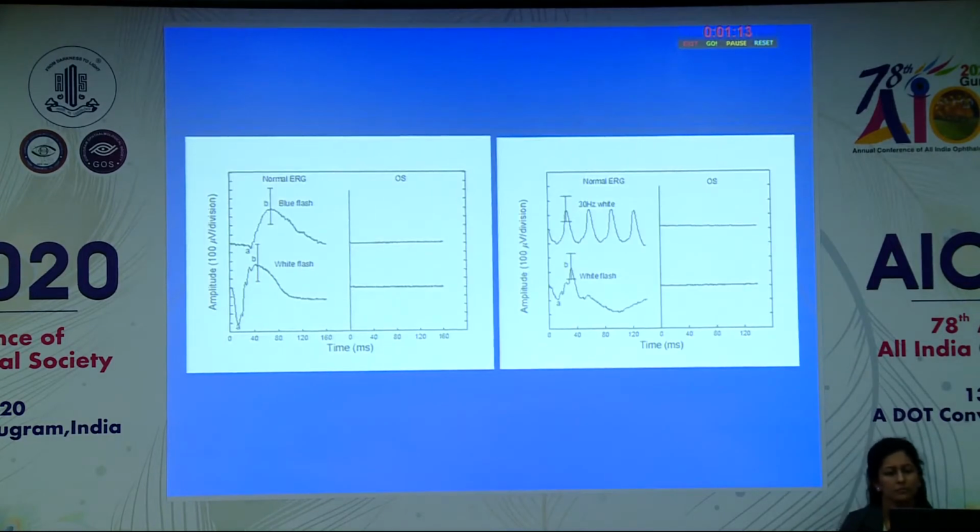We did an ERG, and on the left side is the rod function, the right side is the cone function. On each one of them, the left column is the normal, the right column is from the patient. So you can see pretty much the rod function and the cone function was non-recordable. So very severe retinitis pigmentosa. I don't have the fields, but the fields were like central 10 degrees, so-called tunnel vision. So severe RP, not too much pigmentary change, but this helped to establish the prognosis of the disease.